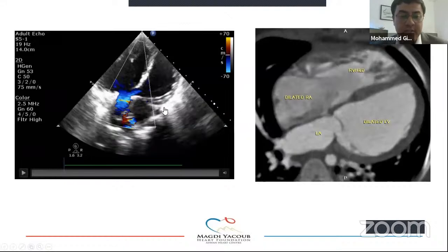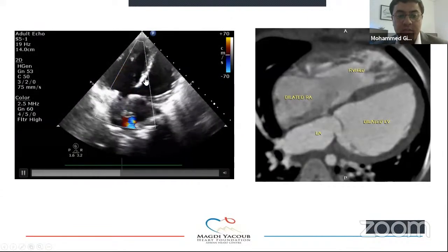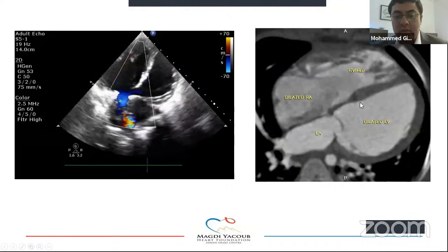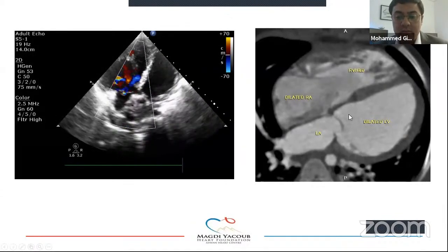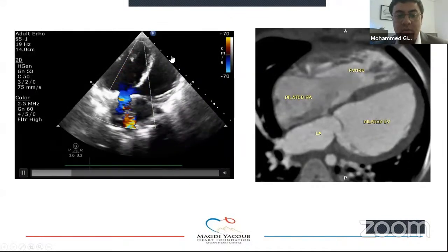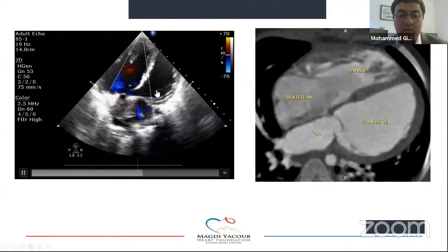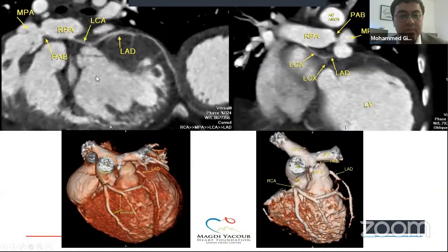So during assessment of the patient, echo was done, as you see here, displaying the poor function of the left ventricle. And CT also was done showing the dilated left ventricle. Okay. But in this case, it was unexpected for the left ventricle to be dilated. Okay, and we think about anomalous coronary origin, like ALCAPA. Okay, so as you see here in this case, this is the first image, a curved MPR image, we traced the coronary arteries and found there is an ALCAPA, anomalous left coronary artery.